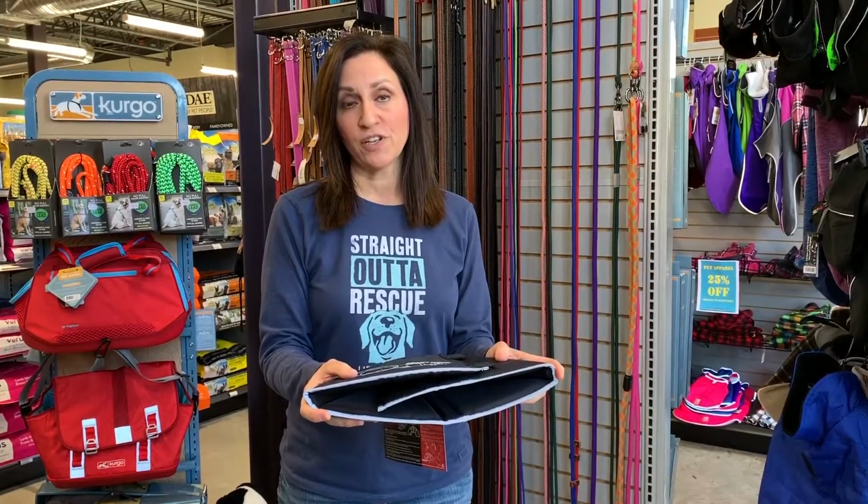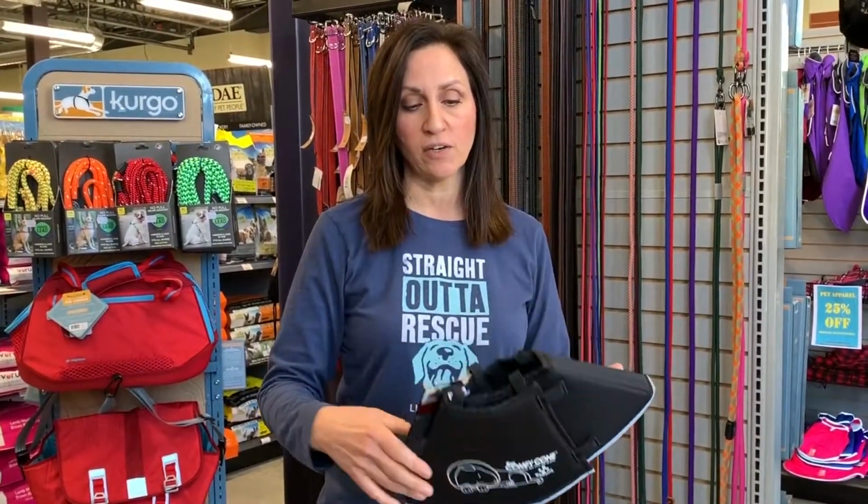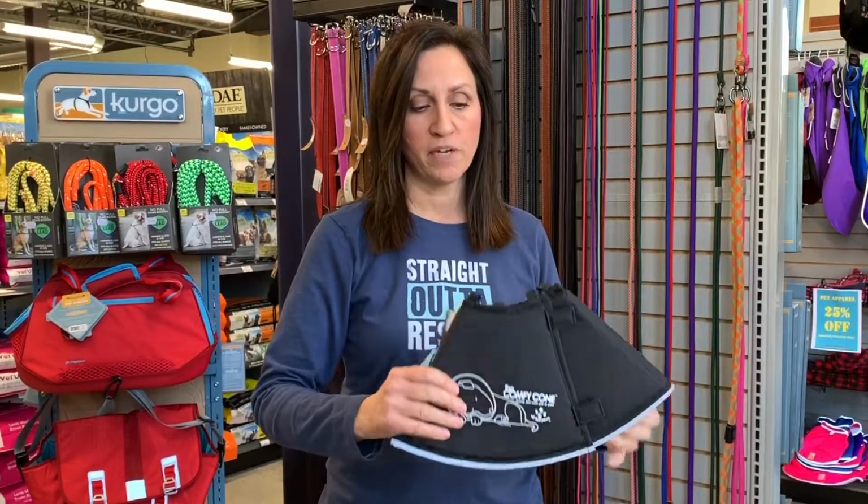Again, a dog with a long snout can sometimes still reach the incision. So even though this thing fits around their neck, you might want to choose the next size up. These do come in sizes. All of these come in sizes. You might want to choose the next size up because it not only gets bigger around the neck, but it also gets wider this way.